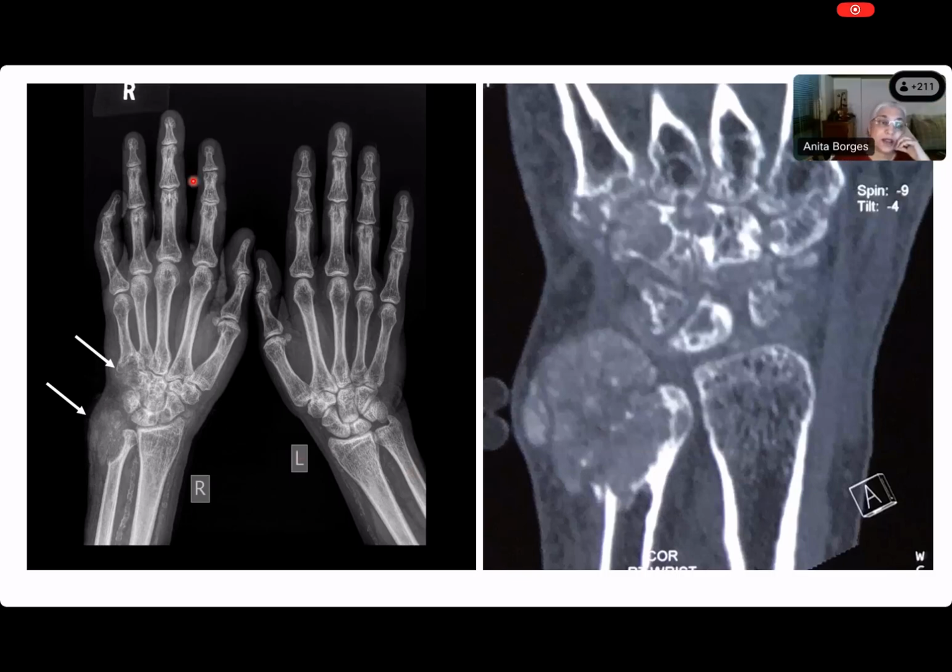The joints. Now you see both these hands. Do you know how many joints there are in our hands? We've got the wrist joints, the metacarpophalangeal joints, and all of the joints of the phalanges. And there are joints between the carpal bones, which don't move. We can't move those joints. We can only move the wrist. We can move these. So you should be able to see cartilage here. So can you see the cartilage, Mansi? And the answer is yes, there is cartilage there, because there is a black line at each joint. So you didn't have to look very hard, Mansi.